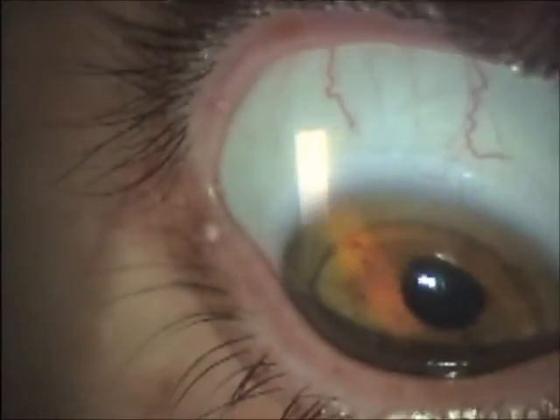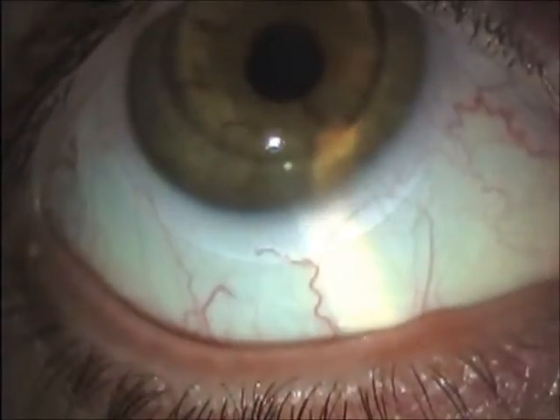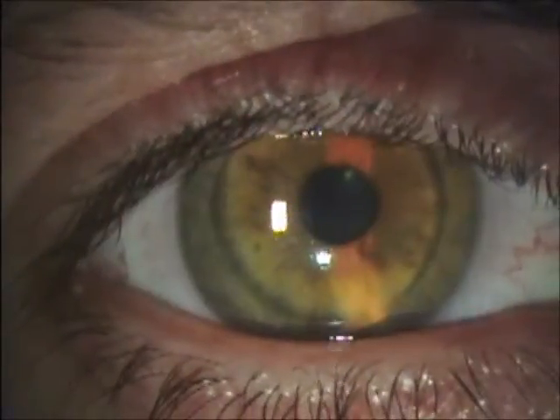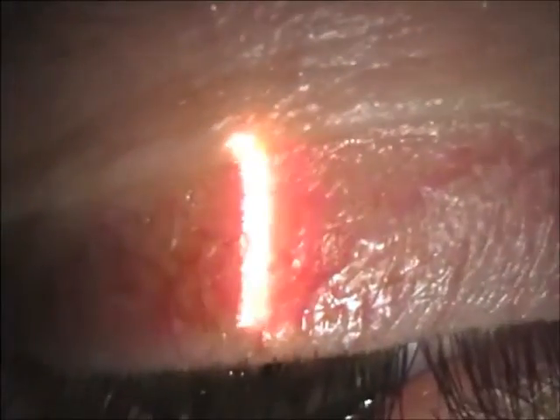First, we tried the adaptation of a hydrophilic contact lens, but the visual acuity was not good. Then we tried with a semiscleral contact lens, but the cornea is too flat.